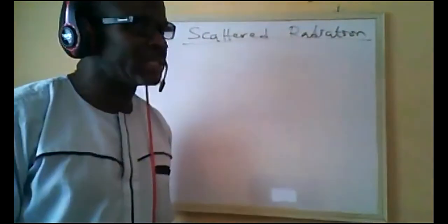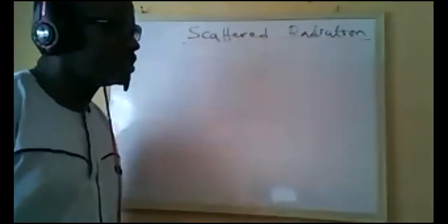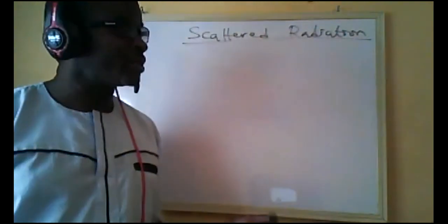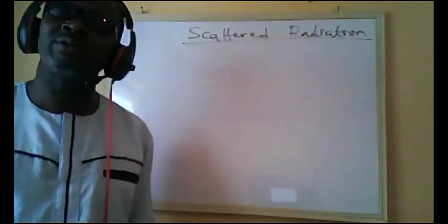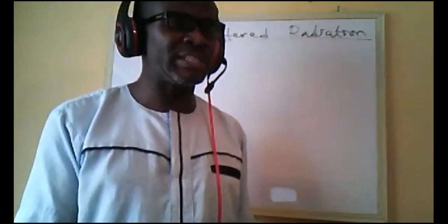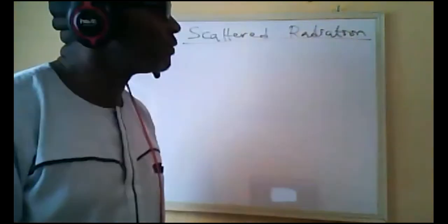And one of the means of doing that is by using the anti-scatter grid. The anti-scatter grid is one of the tools used in reducing scattered radiation. In modern radiography machines, it is always in front of the sensor for digital systems, and above the plate in screen-film systems for conventional radiography.